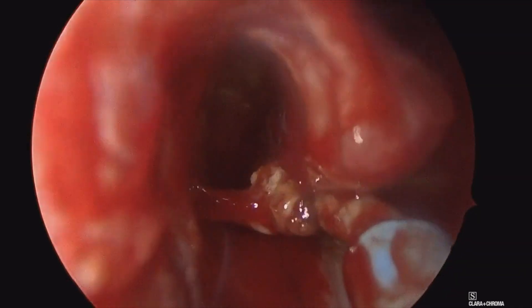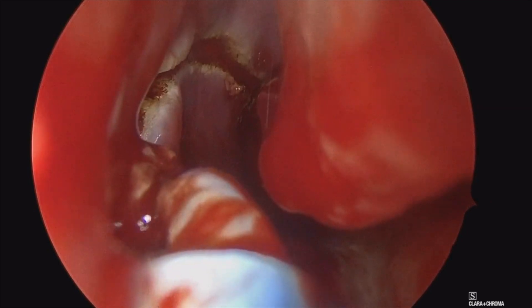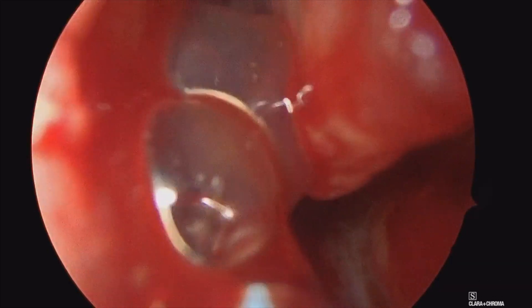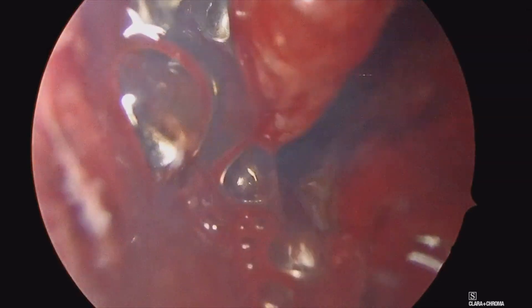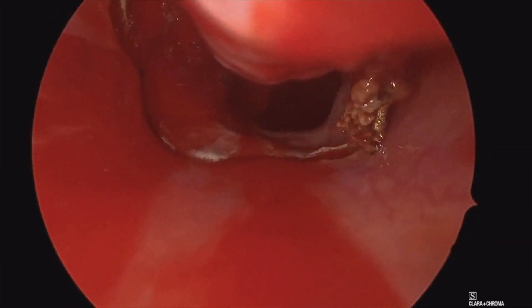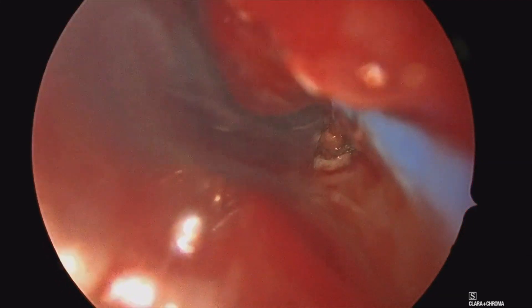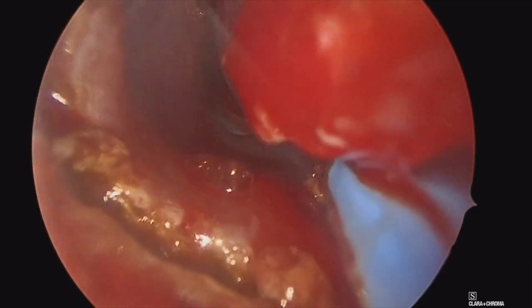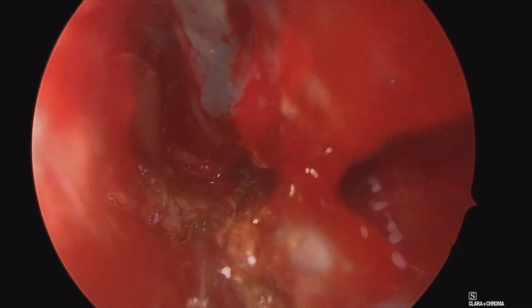On the lateral portion of the inferior meatus, we're up high on the wall there to make this quite wide. We do make sure that we stay just inferior to the nasolacrimal duct in Hasner's valve to ensure we don't cause any epiphora post-operatively. It can be fairly challenging to work in the inferior meatus and visualization can be tough as the inferior turbinate is always sort of hanging in your camera. But the key thing is to use a suction to evacuate smoke as you go and then make those incisions clean down to the bone.